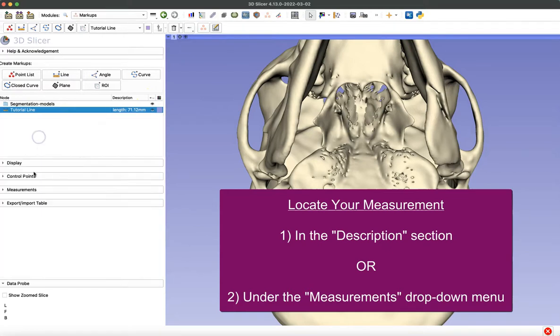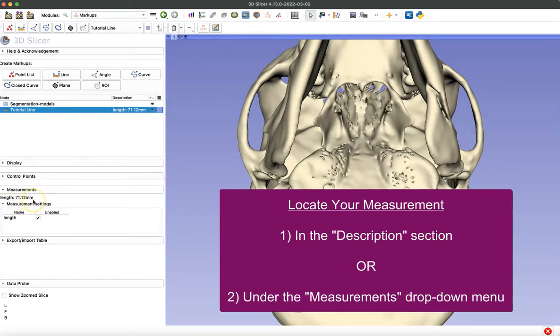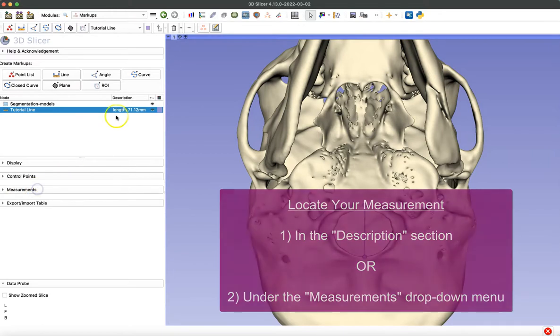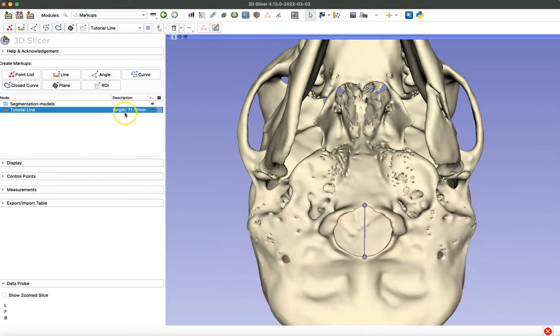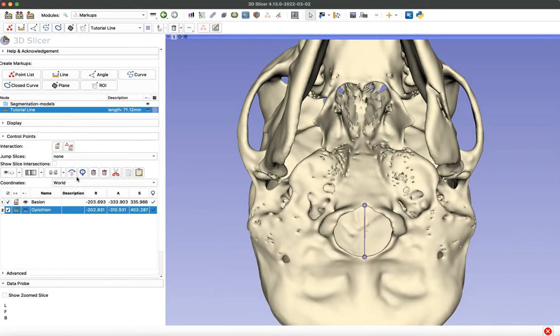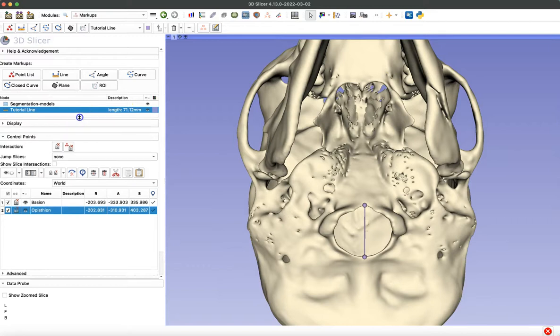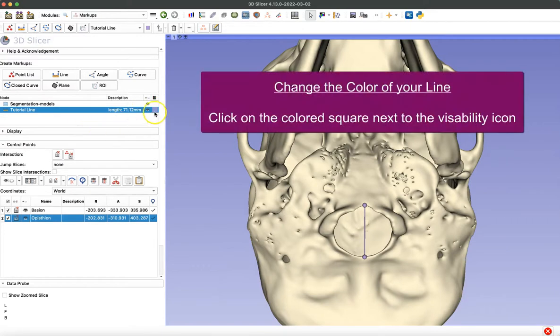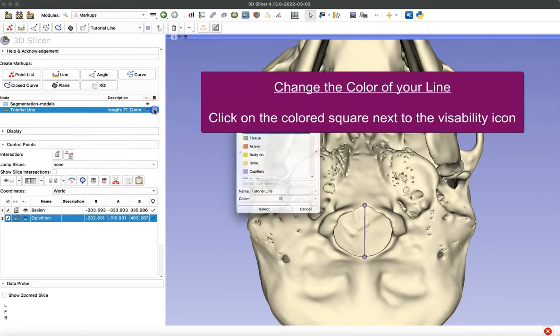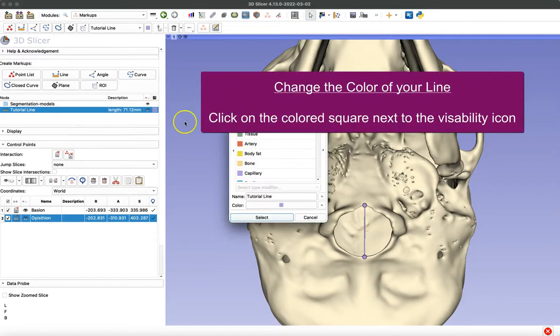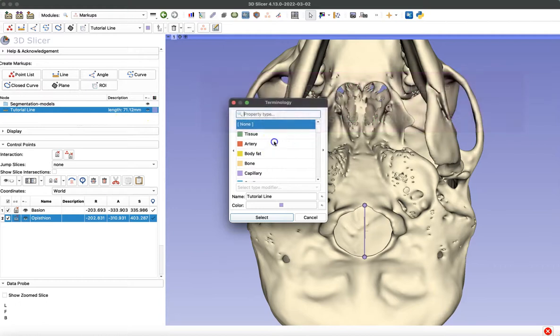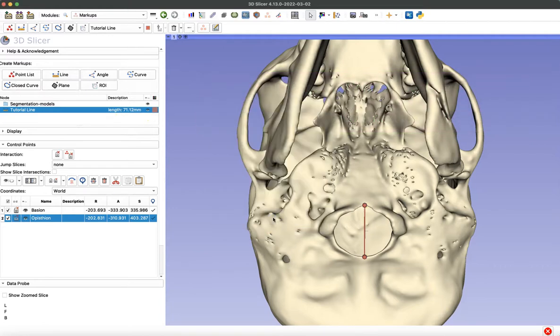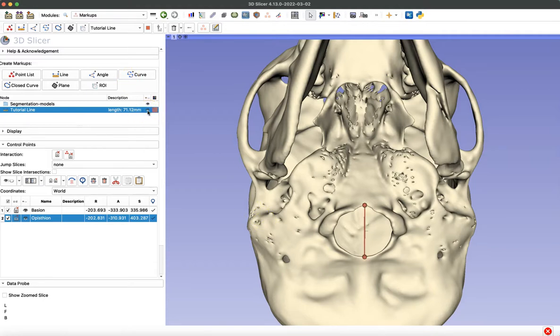So I'll close that control point section, open the measurement section, and it's there as well. You can also change the color of your line by selecting this icon to the right of the eye icon and choose any new color you'd like. And you can also toggle on and off the visibility of your line, not just the individual points, by using that eye icon as well.